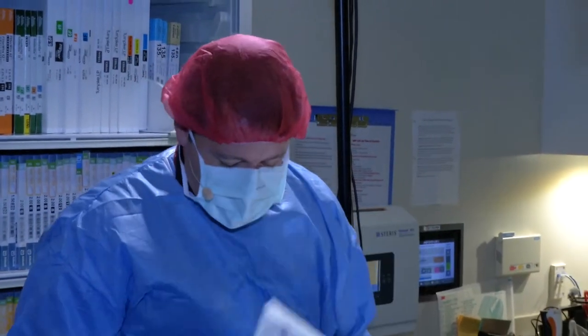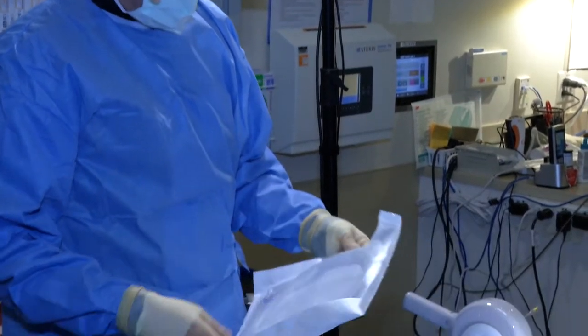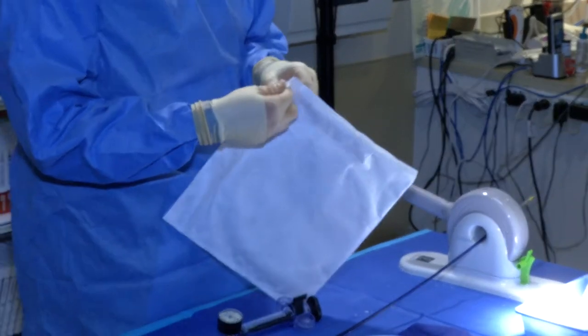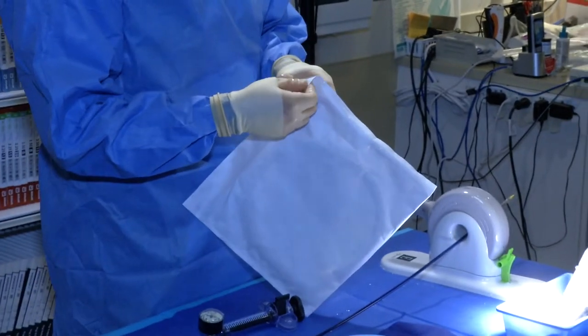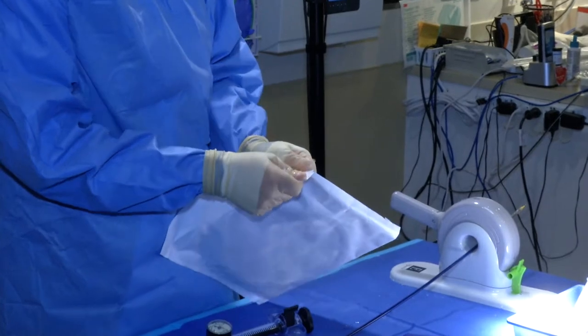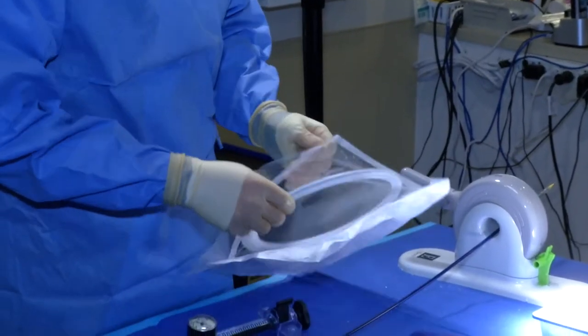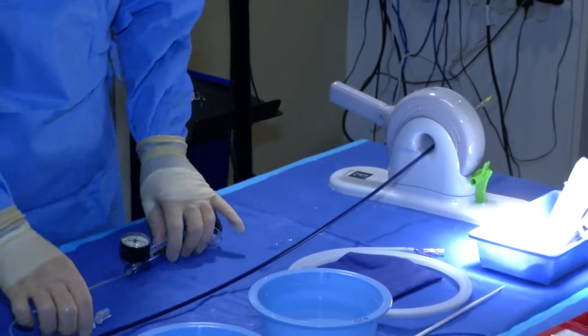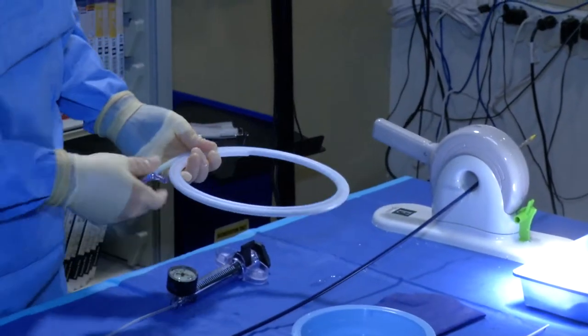And what we're going to do now is prep a 20x4 balloon just in case it is truly that tight, because we don't want to be unable to cross with the valve. So we want to create a nice channel with a balloon so that we can cross with the valve later. I'll just prep that balloon real quick.